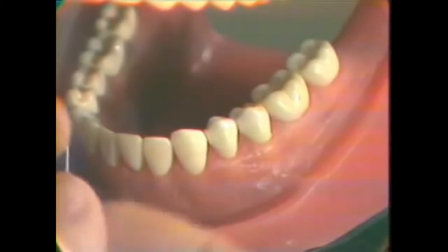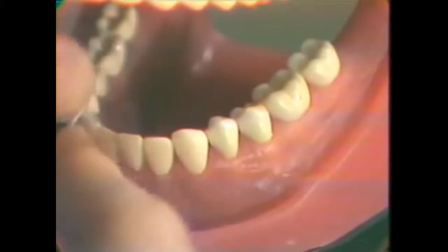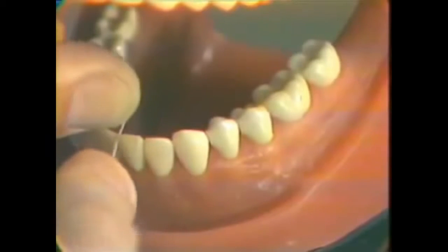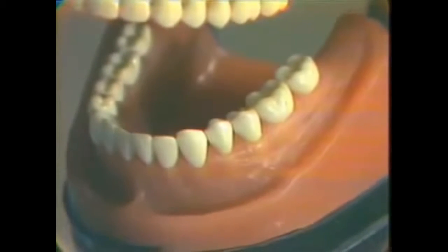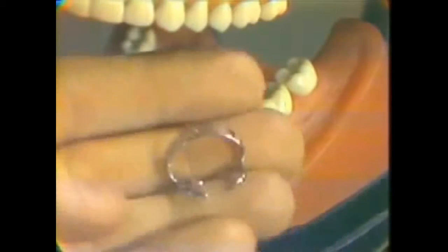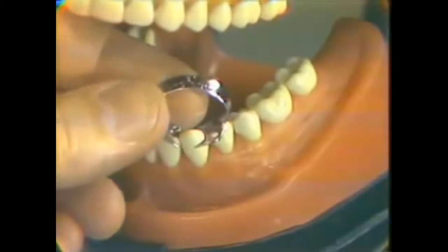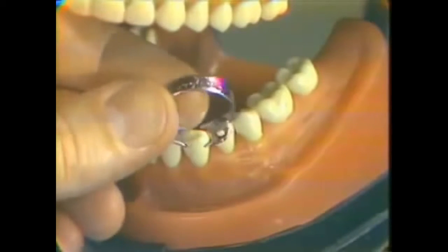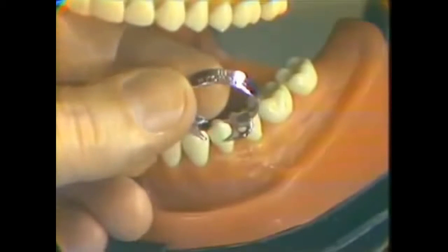Interproximal contacts must be pre-tested to be sure that it will be possible to carry the rubber dam material through them. It's also necessary to pre-test the clamp that is going to be used to retain the rubber dam on the most posterior tooth. In this case, we're selecting this lower molar clamp.